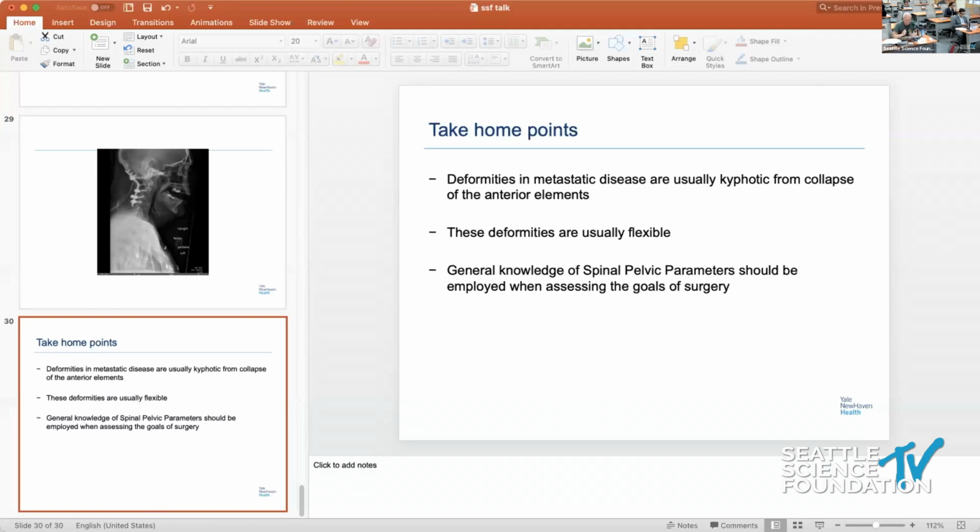Yeah, no, I think that when we are doing our surgical planning, a lot of times we use either software or radiographically we try to aim to return the patients, by different surgical techniques, to a more neutral alignment. They're so flexible that, as we've talked before and as we've shown in the cadaver courses and some of the previous talks, with adjuvant instrumentation, either the corpectomy cages, cantilever techniques and positioning, you can achieve significant reduction of their kyphosis and return them to a much more neutral alignment.